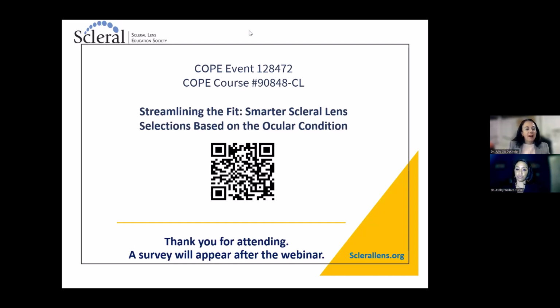Nothing. I determine the markings so that when I am talking to the consultant and telling them how much I want to change my periphery, steepen or flatten it, I always tell them where those markings are, so that they can better change the fit of the lens. The location becomes even more important when I'm adding front surface toric optics, because I measure to the exact degree. That's how they know how to put the power on. So that's when it's so important to have them specifically marked, and that's why I mark it every time, because I never know when I might need to transition to putting a front surface toric on the lens.